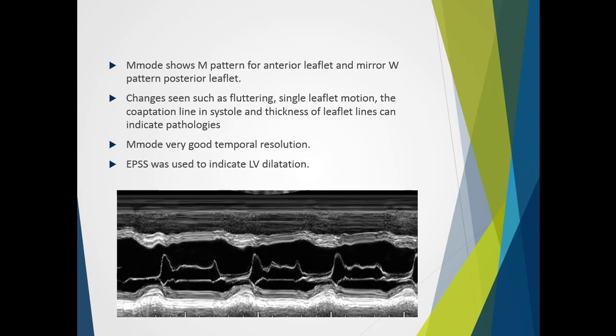M-mode shows a typical M pattern for the anterior leaflet and a mirrored W pattern for the posterior leaflet. The excursion of the anterior leaflet is much larger compared to the posterior leaflet. Changes seen such as fluttering, single leaflet motion, and the coaptation line being thicker in systole indicate pathologies. While not a significant part of the common scan these days, M-mode has a significant benefit in assessing timing events and has very good temporal resolution.